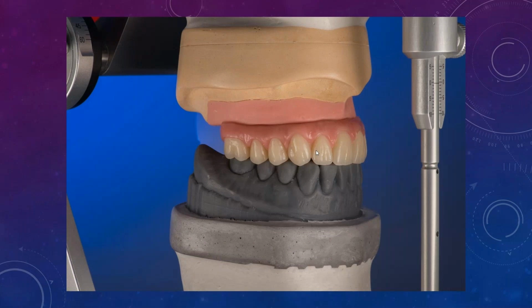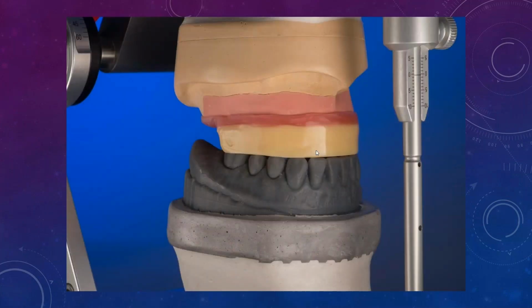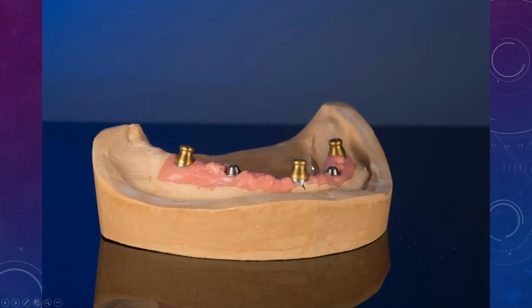So basically, once you convert things, either we're doing wax rims or a duplication of the patient's existing temporary prosthesis, from this point you're going to have to start designing your bars, guys. And hopefully, when you did your designs, everything went great. I'm going to show you a couple of slides for the new setup, which I basically just explained already. So we have wax rims. These are the low conversion abutments that I use; you see they convert from multi-unit to the locator. Sorry, I spaced out and said we're going to be designing bars, but I'm going to go back just a little bit to show you the new setup because it's got some interesting things.